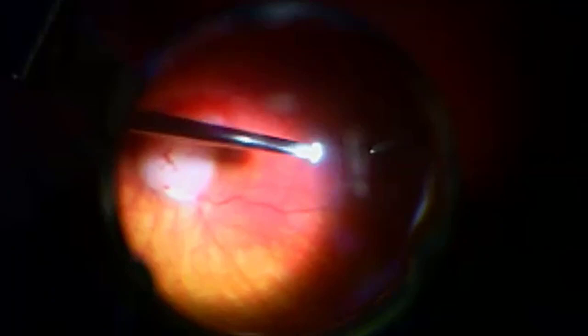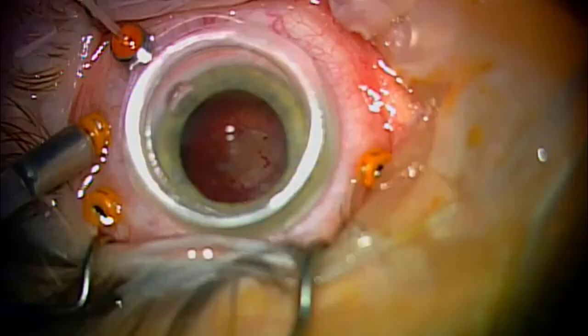Vitrectomy was then completed in the standard way, and the view was switched to the contact lens to achieve better resolution.